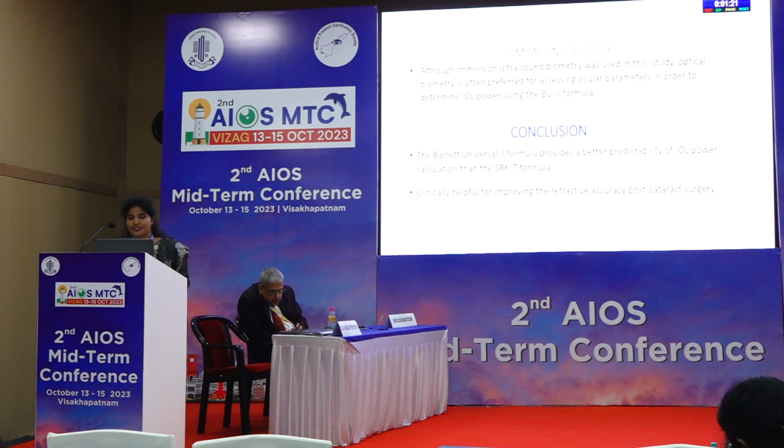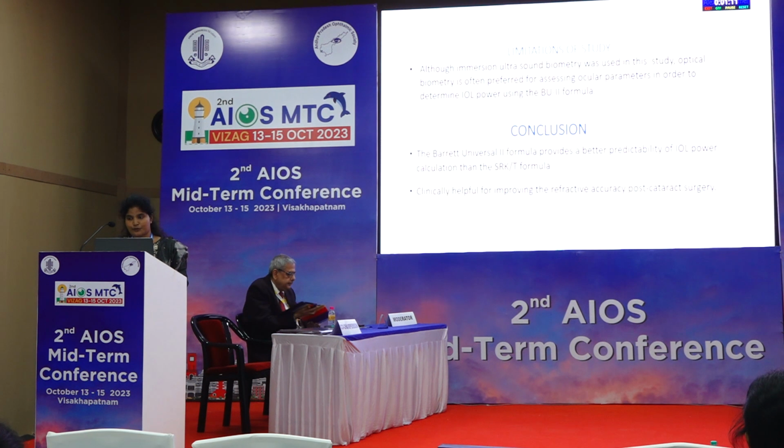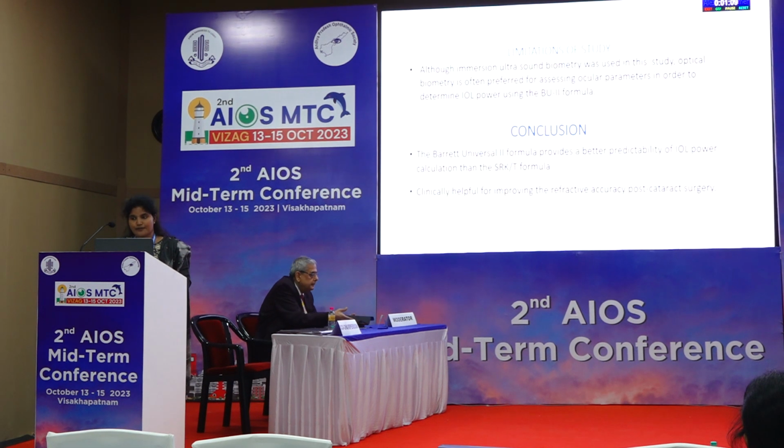The limitation of the study is that although immersion ultrasound biometry was used, optical biometry is often preferred for assessing ocular parameters to determine the IOL power using the BU2 formula. The conclusion of the study is that the Barrett Universal 2 formula provides better predictability of IOL power calculation than the SRKT formula, clinically helpful for improving refractive accuracy after cataract surgery.